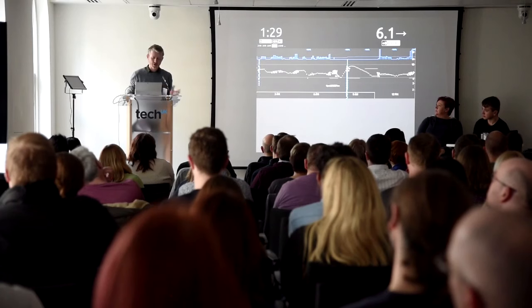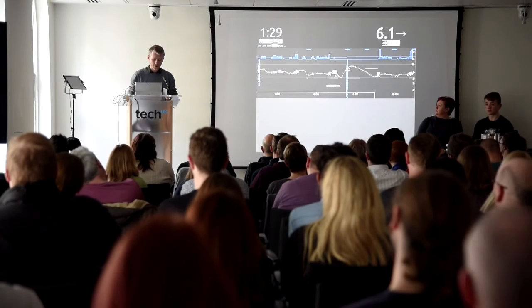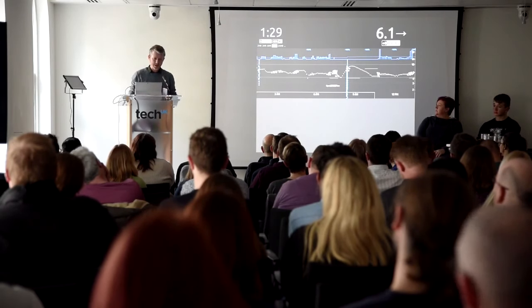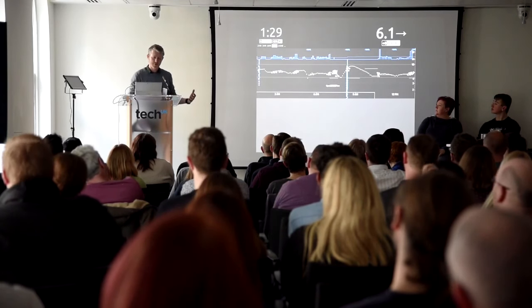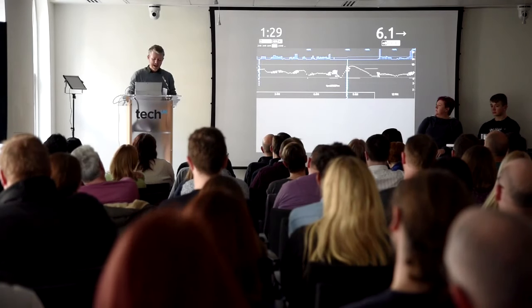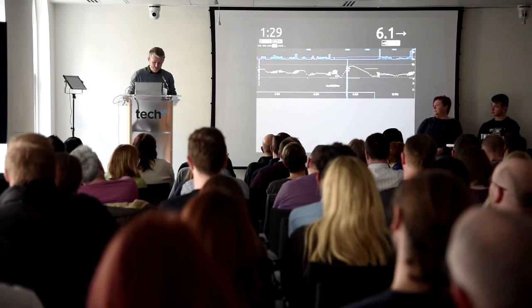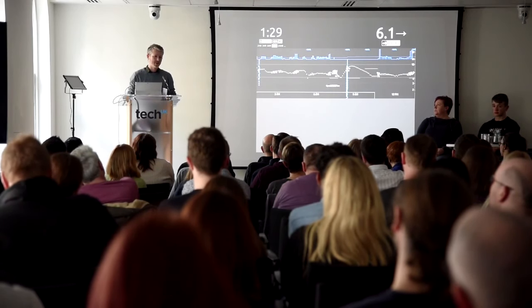Linzi said it's not a cure. You have to remind yourself of that. It's a tool to support good control. You still need to know what's going in and out of your body. You still need to understand the factors that affect your diabetes and accept that they'll change over time, and that's where things like auto-tune are so useful. It only works as long as you have accurate CGM data. But if you accept all those things, then I really believe this technology has the potential to change your life.